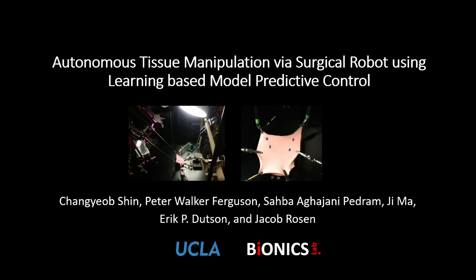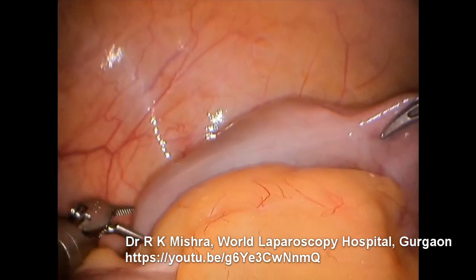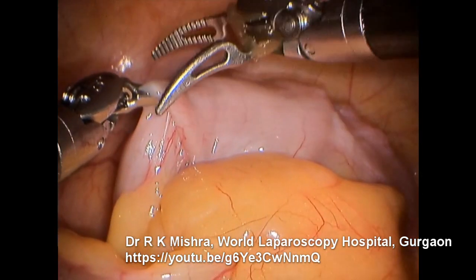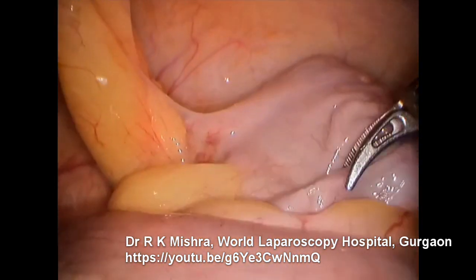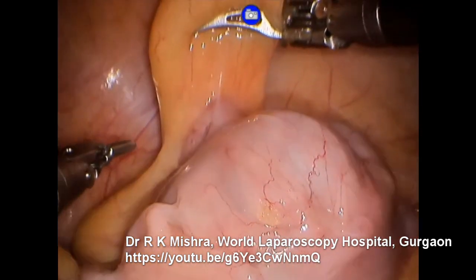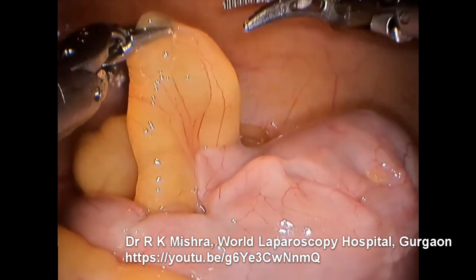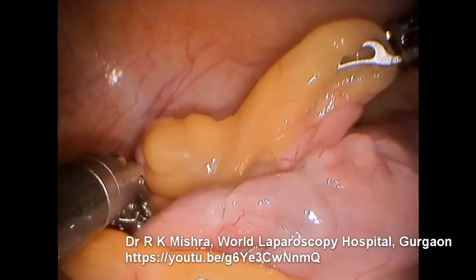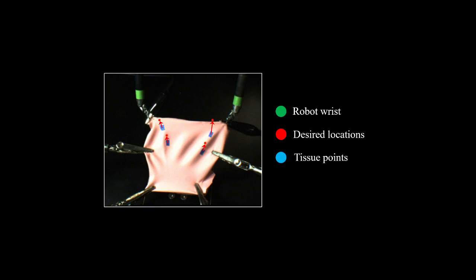We present reinforcement learning and learning-from-demonstration algorithms envisioned to automate tissue manipulation with surgical robots. Tissue manipulation is required in many surgical procedures, so it is a candidate for robotic automation. However, automated tissue manipulation is considered a challenging problem because of the highly complex dynamics of soft tissue. Our target task is placing the points on the tissue to the desired points with indirect manipulation.